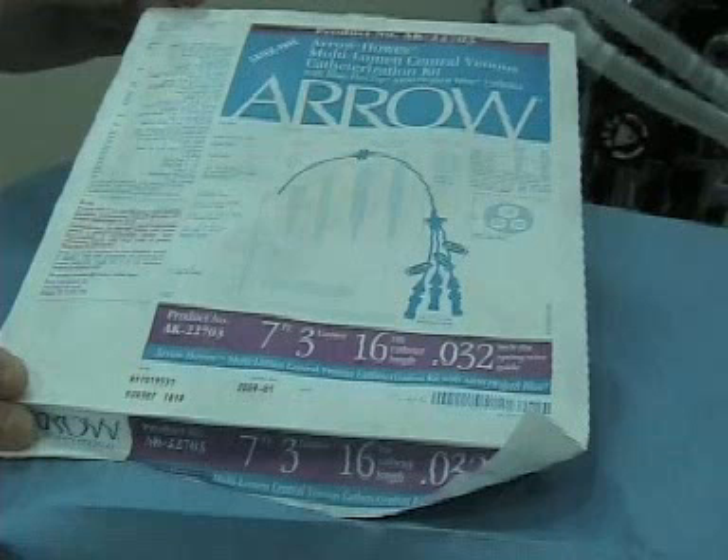Which kit should you use? You can use any kit that you need. You might use a 7 French 3-lumen kit for your femoral venous line if you don't need a lot of volume. Of course, if you do need volume, or if you need to put in a Swan, then you'd put in an introducer.